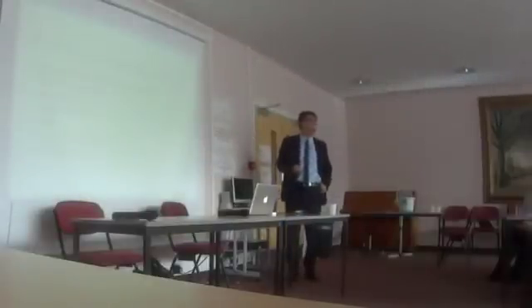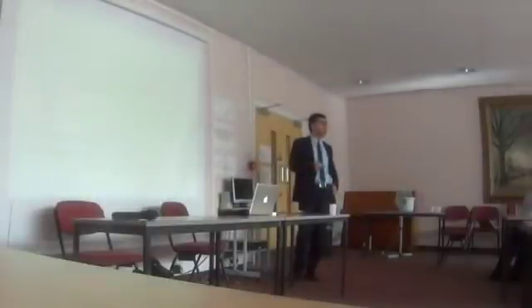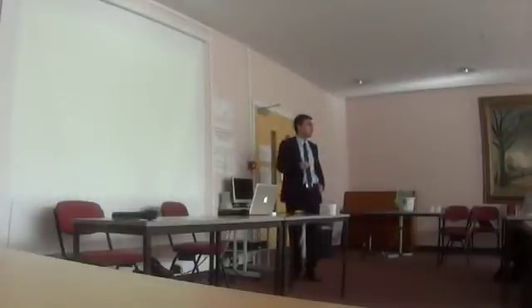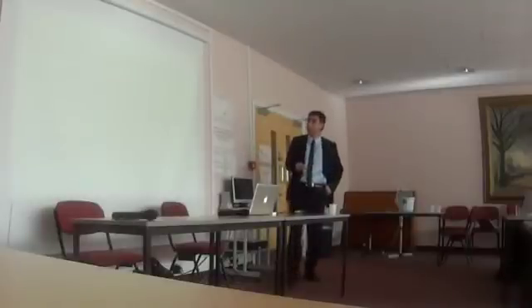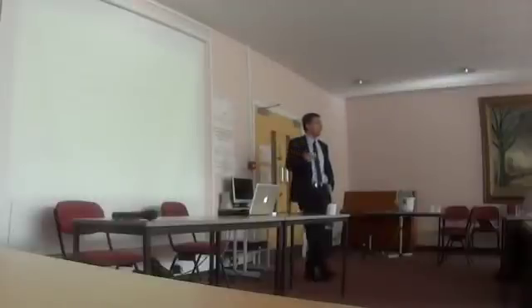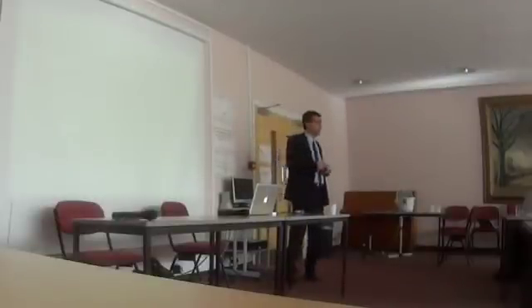So we did the echo, it was abnormal, then we gathered all the other information. Unfortunately, image quality on the echo was poor. Some people don't have a good image quality with the echo. Some of you may have gone through this. Some of the quality is good, some not, for various reasons. But his was not good at all. We knew that the heart was not pumping very well, but we could not establish anything. What we knew was that the gradient had disappeared. We knew that he had a gradient across the LVOT, but it was not there anymore.